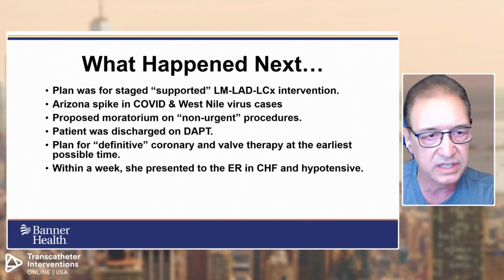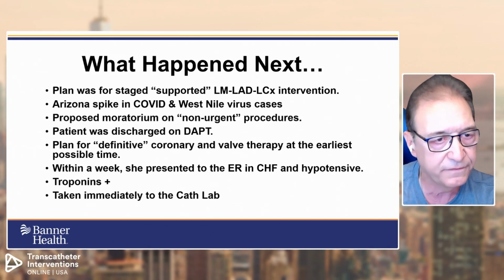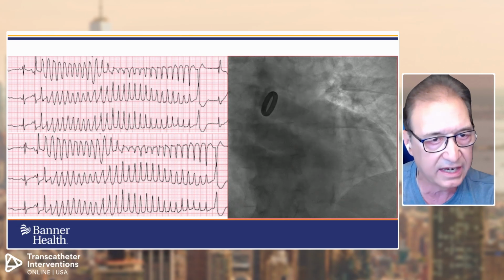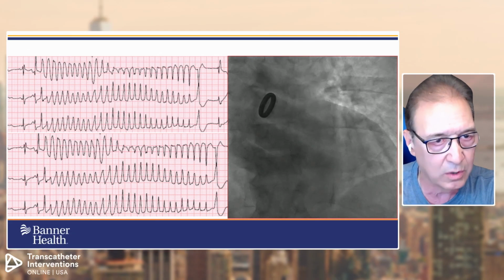to do this case. Within a week, she presented back to the ER, again hypotensive, in heart failure with positive troponins, and so she was taken immediately to the cardiac catheterization laboratory. And you can see on arrival to the cath lab what we faced.